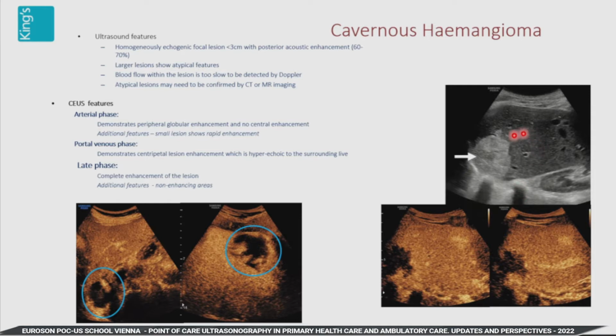And it's very simple to make this diagnosis, because classically the hemangioma is that echogenic, sometimes quite large lesion, but you're looking at this globular enhancement as it comes through from the periphery with the contrast and works its way down. Why is contrast-enhanced ultrasound better than any other imaging for this? Because not only are you not irradiating the patient, you're watching it in real time. So you are making the diagnosis, watching and storing it on video and assessing every frame.